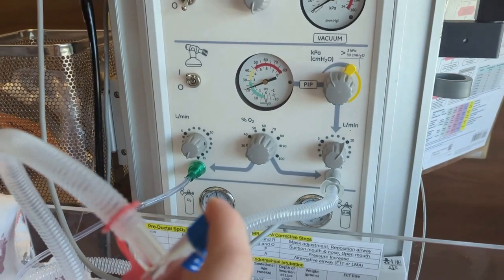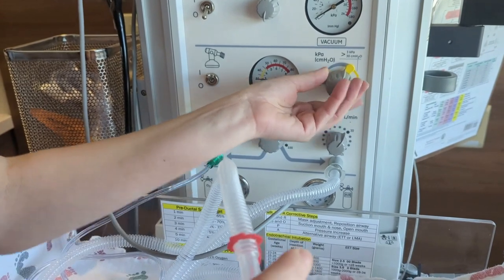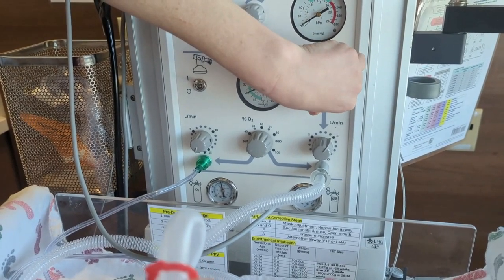So we look good. To adjust our PIP, we would come over here. It's going to put us at about a hard stop at 30. If we wanted to go higher we can, but we're always going to start off at 20.